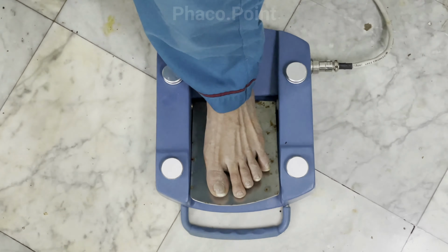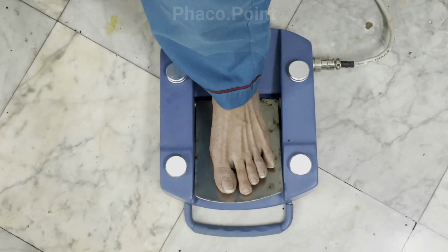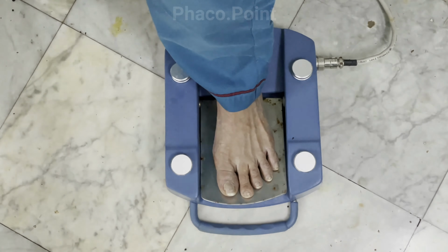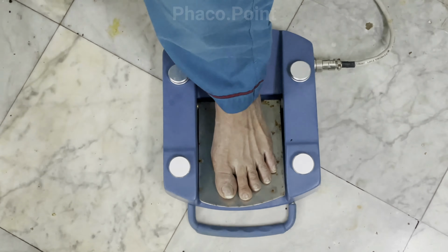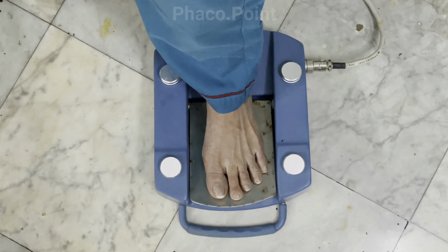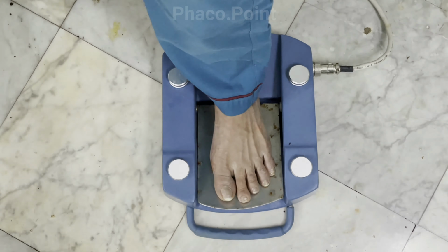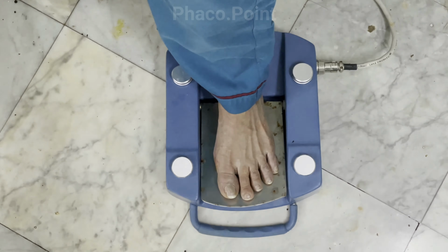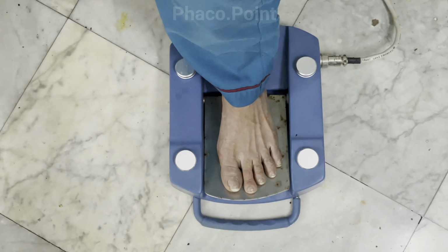Let's look at the foot pedal control for fragment removal. So the fragment that you want to emulsify should be opposite your tip, and you are currently in foot pedal 1. Whilst remaining in foot pedal 1, the probe now moves close to the fragment. Now, which part of the fragment are you going to emulsify? You don't hold it too superficially, neither do you hold it too deep. So, whilst remaining in foot pedal 1, the probe now is taken against the fragment somewhere midway down its depth. Now you're ready to emulsify.